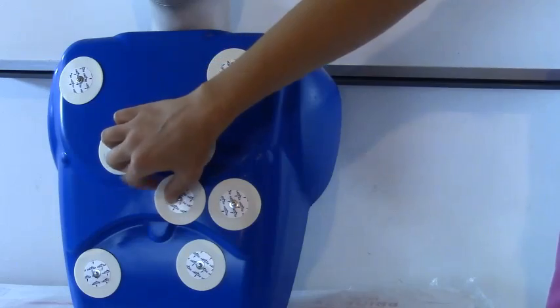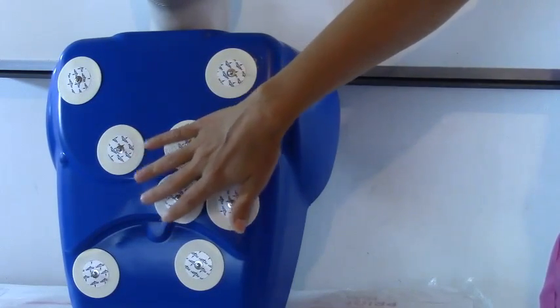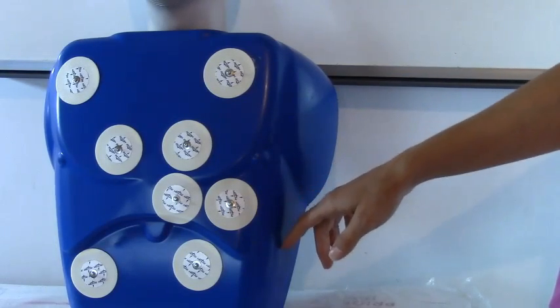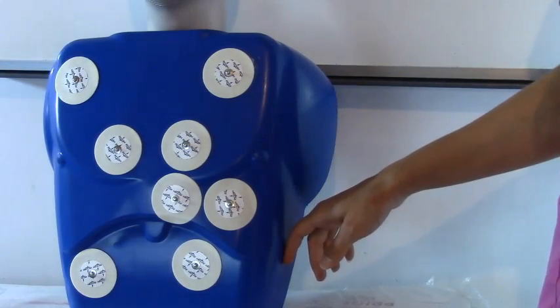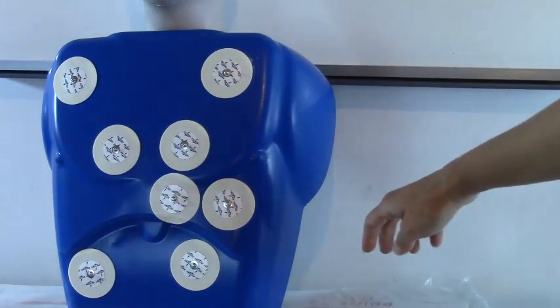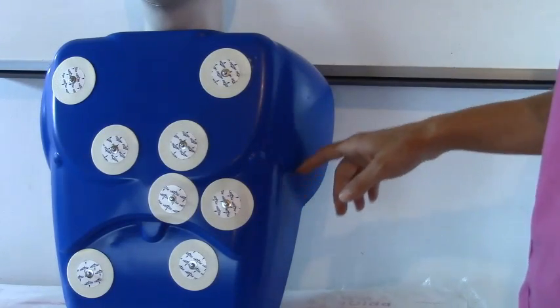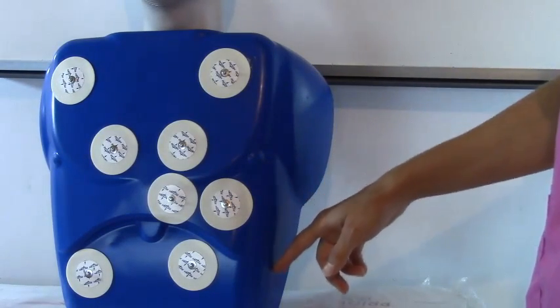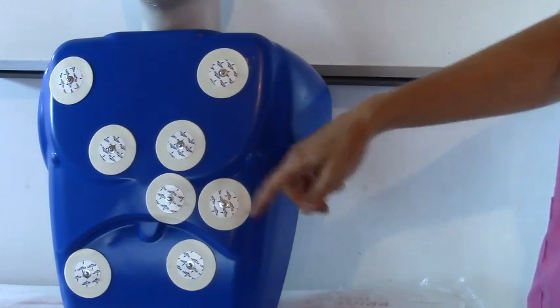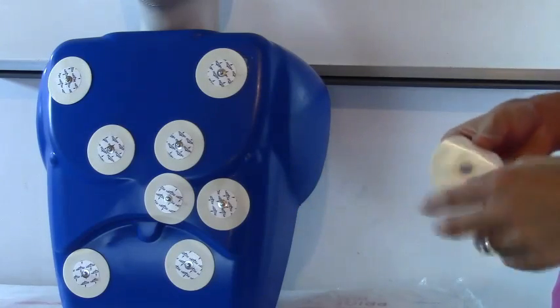And we're going to place that here and now we're going to skip to V6 and we'll come back to V5 and V6 will be right here and it is going to be mid-axillary and it's going to be the same level as V4 which is right here. So you're going to find the armpit and you're going to go in between in the middle of where the armpit is so about right here on the patient lining it up with V4 so right here is where V6 would be.